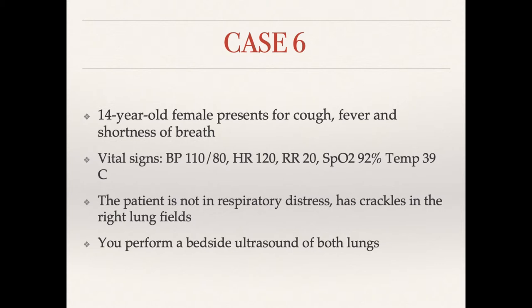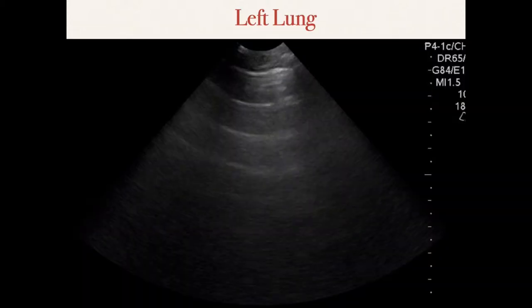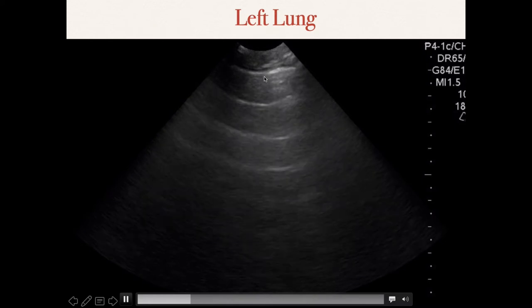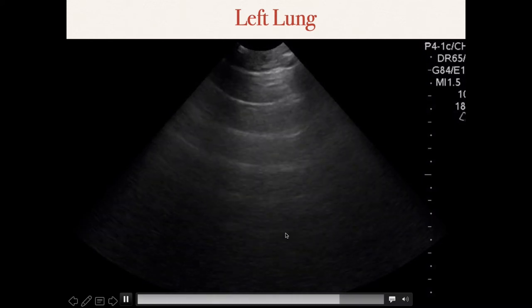Case number six: a 14-year-old female presents with cough, fever, and shortness of breath. Vital signs: blood pressure 110/80, heart rate 120, respiratory rate 20, oxygen saturation 92%, temp 39 degrees Celsius. The patient is not in respiratory distress and has crackles in the right lung fields. You perform bedside ultrasound of both lungs. Here's the left lung - using a curved probe with a lot of depth, looking for pleural sliding. There is sliding and many A-lines - that nice reverberation artifact with sliding usually means a normal-looking lung.